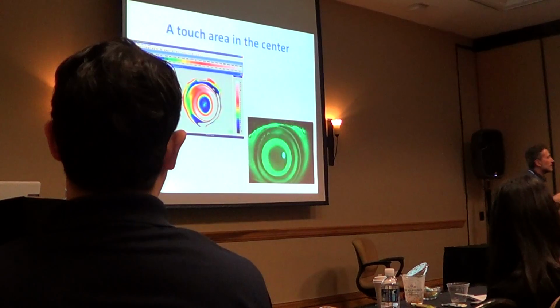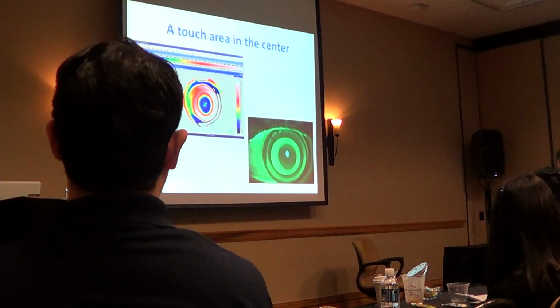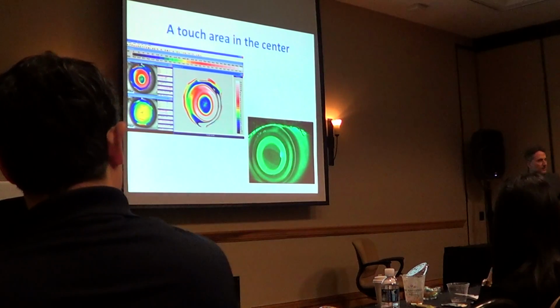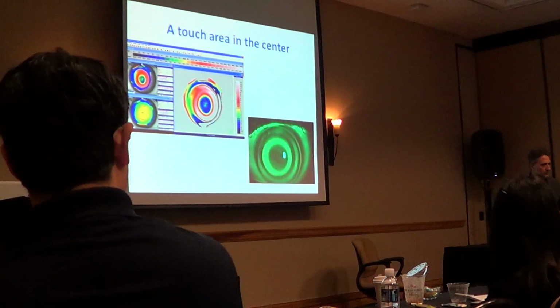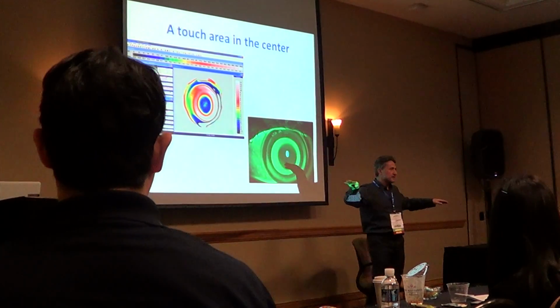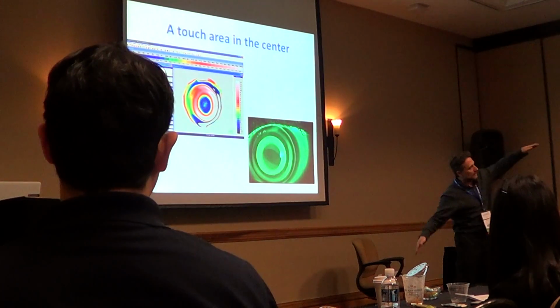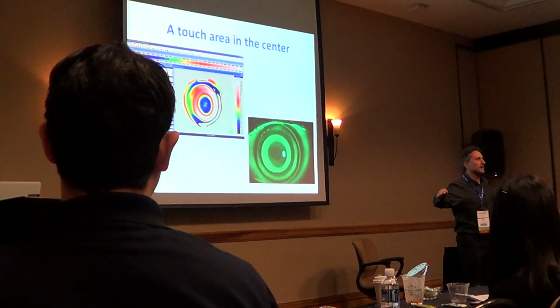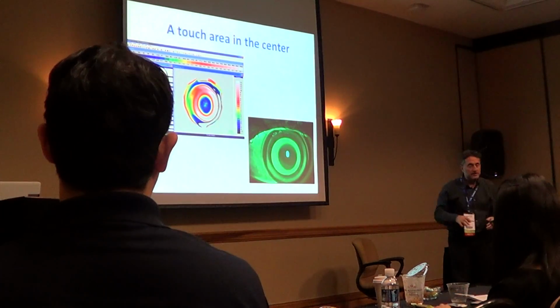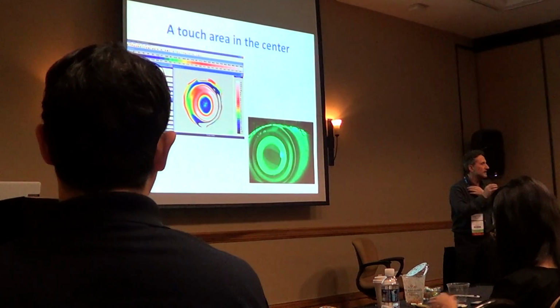Now we know what we need to do here. We need to increase the sagittal height of the lens in the central zone because we don't want touch. So the reverse curve needs to be steepened a little bit to secure the central zone. And the peripheral landing zone or peripheral alignment curve needs to be steepened a little bit to obtain the perfect alignment all around. And the diameter needs to be a little bit larger to obtain the perfect corresponding cornea. So that's the thing we need to do. So looking at that, following the steps, we know what we need to do next.